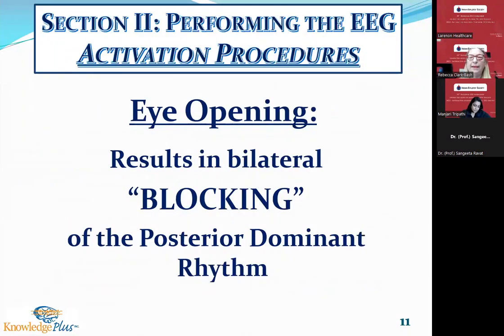Usually I perform eye opening and eye closure 4 to 5 times during the start of the recording. That results in bilateral blocking of the posterior dominant rhythm. The posterior dominant rhythm used to be called alpha, and they removed that name because it's not always alpha. In patients who really don't know who the prime minister is, or what day it is today, they might not have the required minimum 8 hertz, they might only have 7 hertz. It used to be called alpha rhythm, now it is called posterior dominant rhythm.